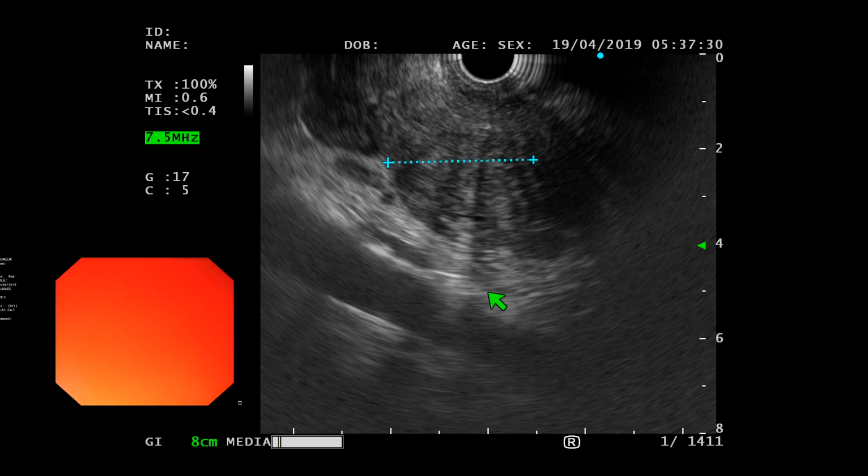I was just measuring the mass for the report. Oh, actually, guys, one of the things we need to do today, before I forget, is take the trainees through the report. Reporting EUS is ever so slightly different from any other reports that you do. Mustafa, I'll come back to your question. I'll just tell them the stepwise report writing. So it really, really helps.